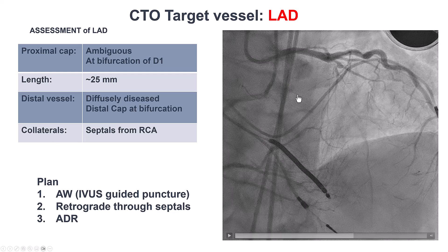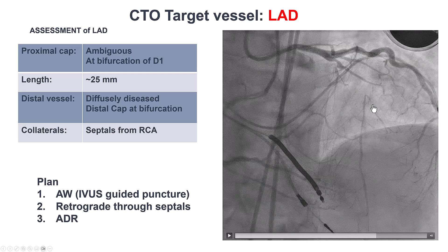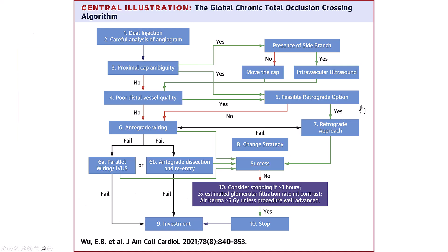The first approach is to try antegrade wiring with IVUS guidance, since we have this diagonal branch next to the proximal cap. The other option is to go retrograde. We left ADR as the last resort because, especially in the LAD, using ADR might result in loss of several branches — both septals as well as the diagonals. Here we have a bifurcation on the proximal cap with the diagonal and a bifurcation on the distal cap with another diagonal, so ADR is the least preferred approach.